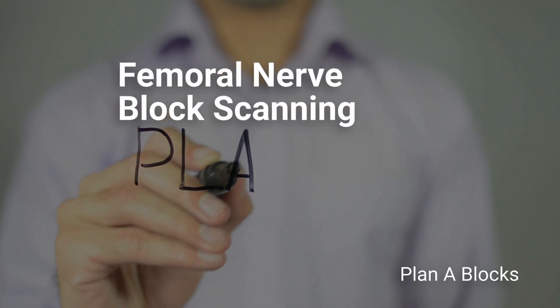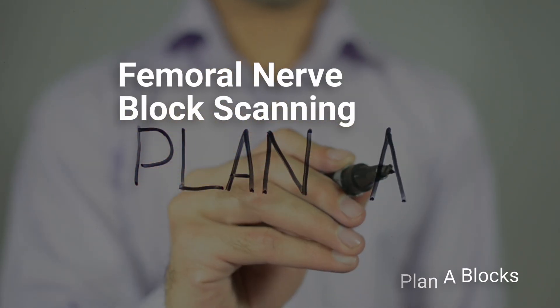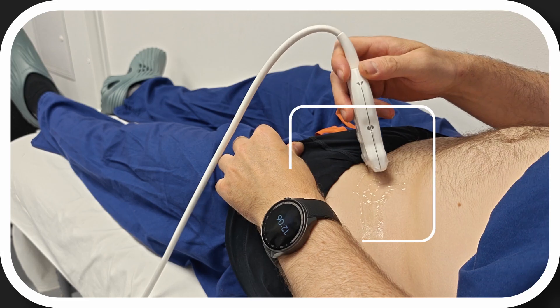Let's look at how to scan for the femoral nerve block. We're going to start by putting the probe in the femoral crease.